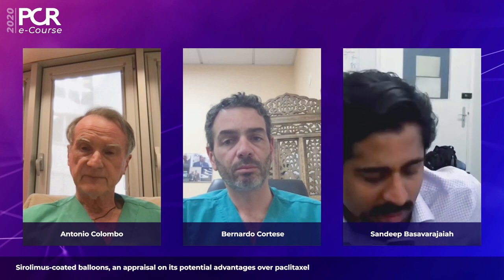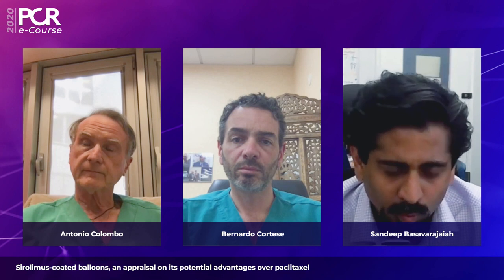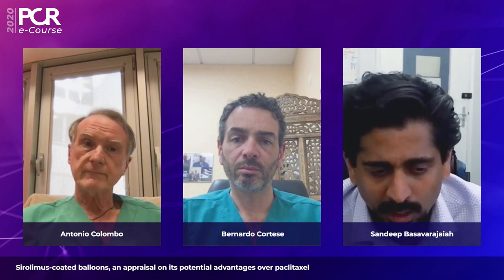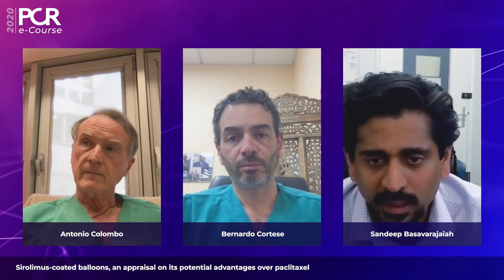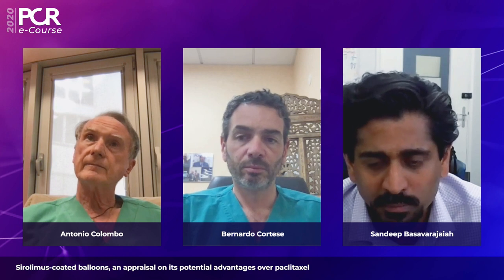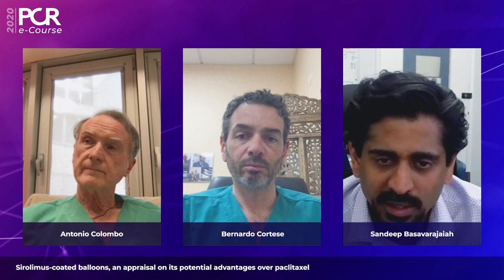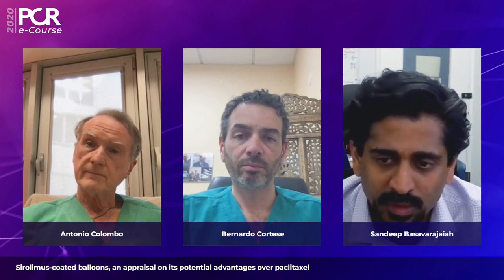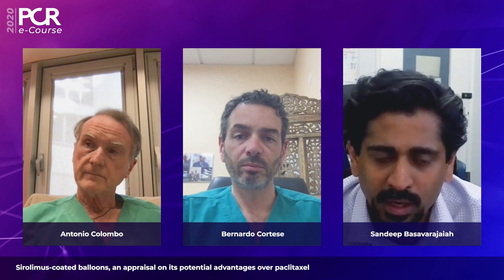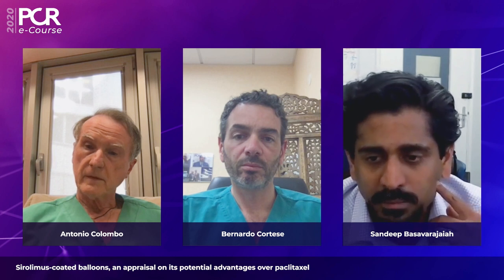I would like to make a point and also ask your opinion on bailout stenting. Now, if I'm treating a 40 millimeter long lesion, and if there is a dissection involving a certain segment, and if I'm worried that it'll progress to a flow limiting, I tend to use a very short stent just for that segment and leave the rest of the DCB segment without a stent. Is it something which you agree, or should we cover the whole treated segment?